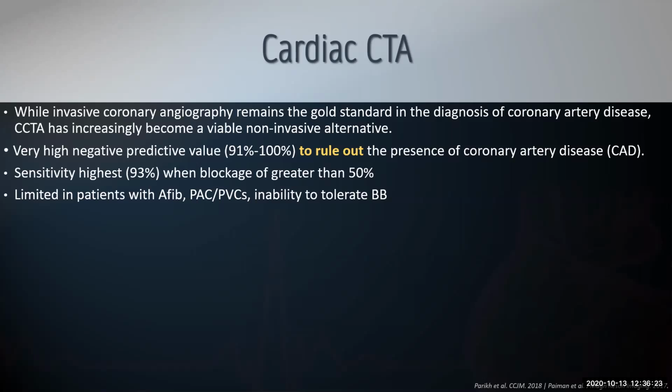There's a lot more contrast exposure with a cardiac cath than there is going to be with a cardiac CTA. So these are all great points that are important to consider when it comes to deciding what's the best imaging modality. And I guess one thing you can get out of this is a time where you might want to talk to the cardiologist and say, hey, I think that this patient we have maybe in the hospital would benefit from a cardiac CTA. What do you think?